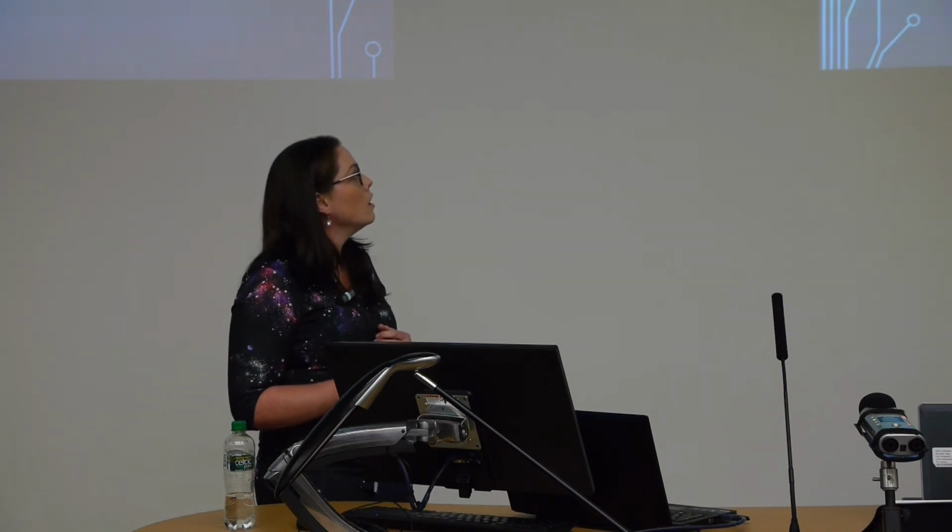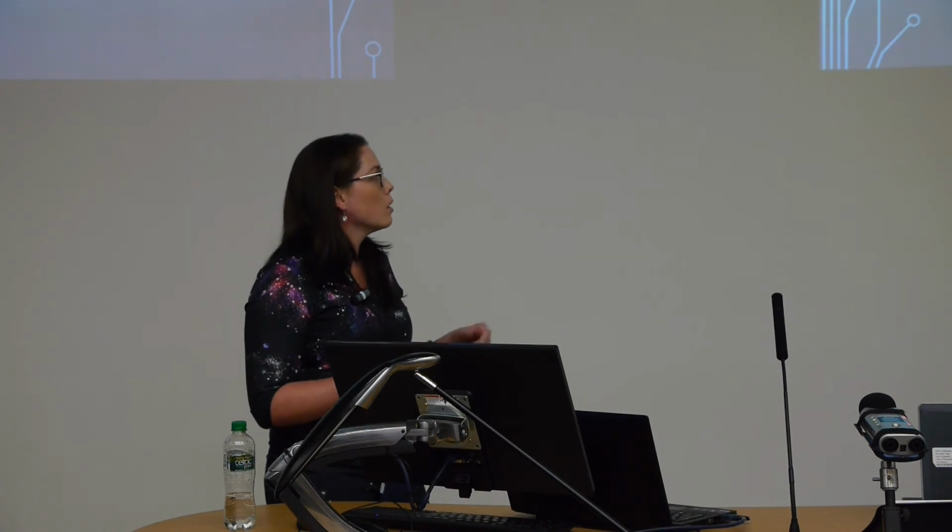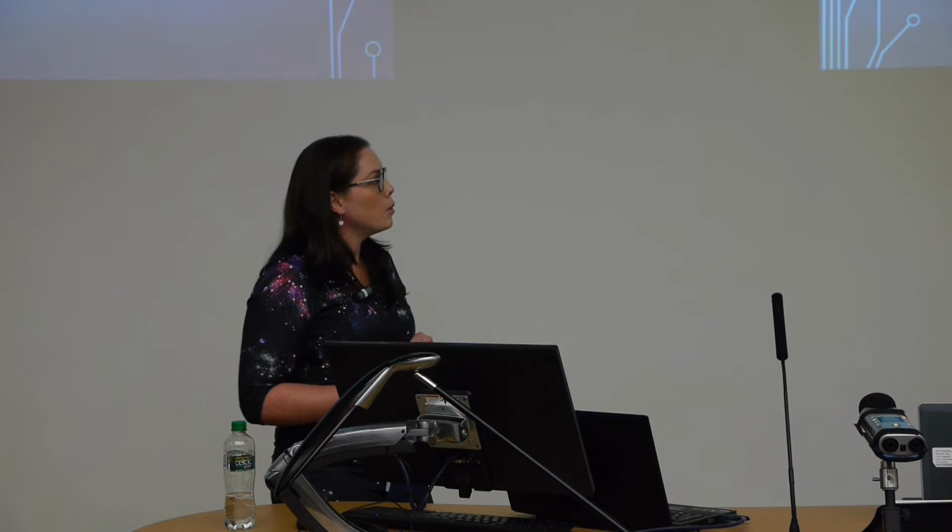What a PET scan tells you about is the cellular burden, the metabolism, but it also tells you a little bit about the function of the tumour. So hypoxia, you can also look at proliferation, and there's some work in looking at intrinsic radiosensitivity and radioresistance. But this is all about bringing it back to the patient.